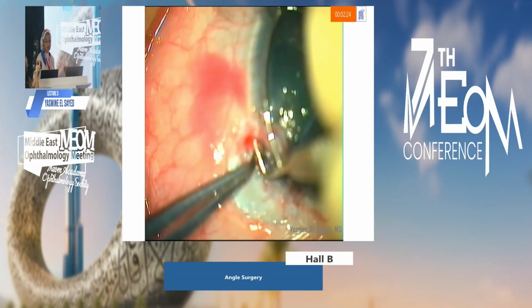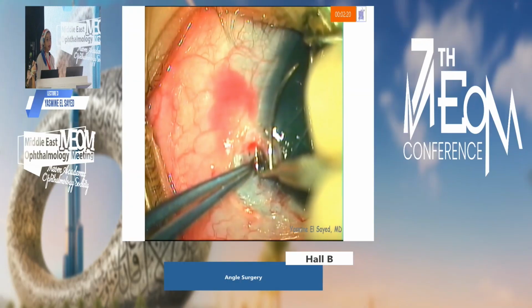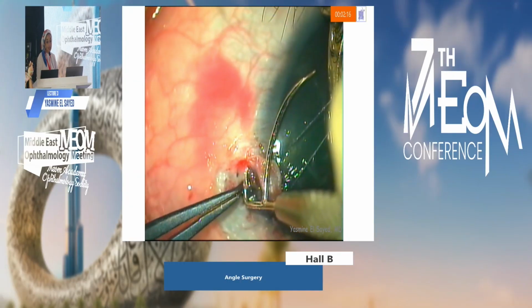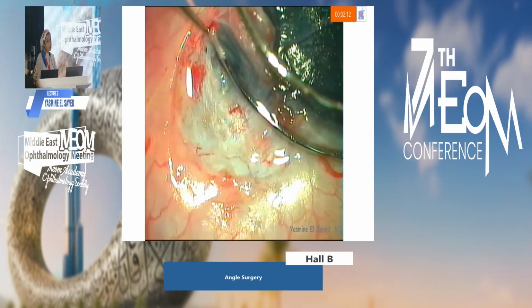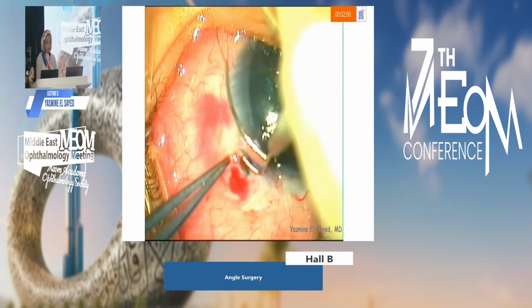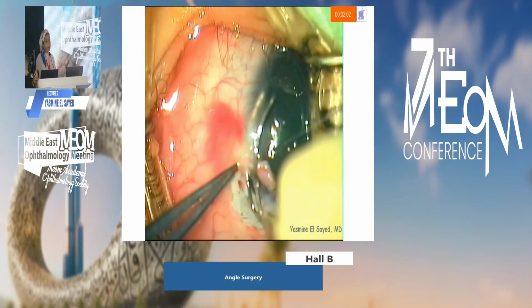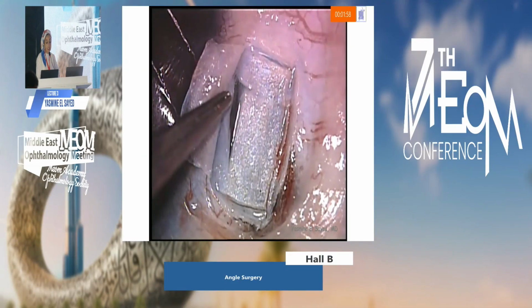So as you can see here, although the probe is going in very smoothly into some plane in the tissues, as I'm trying to incise the Schlemm's canal, there's intense resistance, and it turns out that it's intrastromal and risks creating a Descemet's membrane detachment. But when the section is relocated into the correct plane posteriorly, again, it goes in smoothly, but then in this case, it can dissect into the anterior chamber successfully as well.